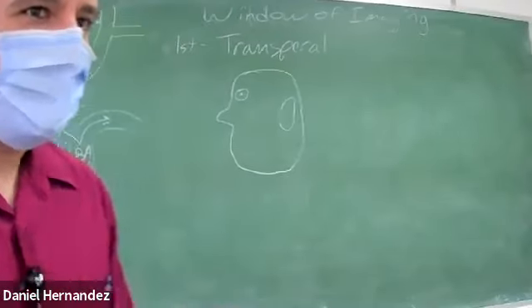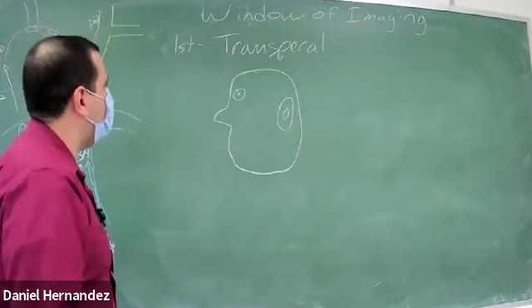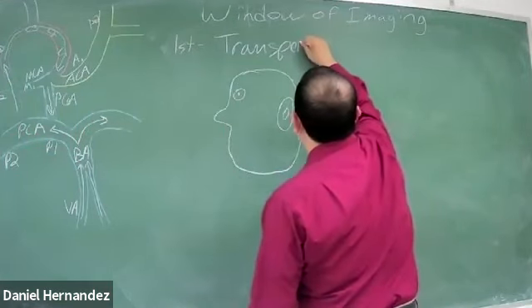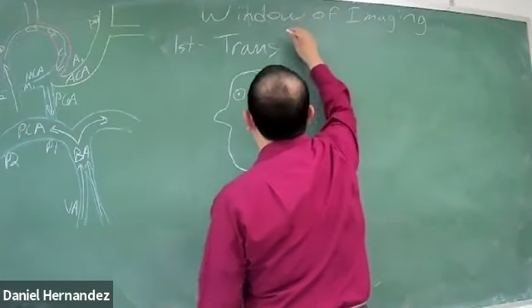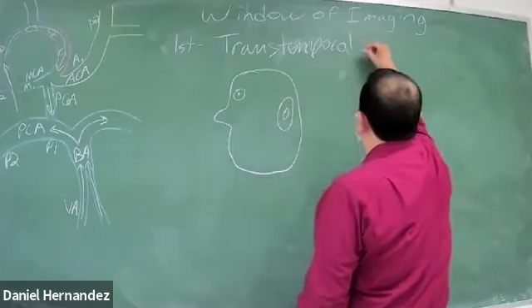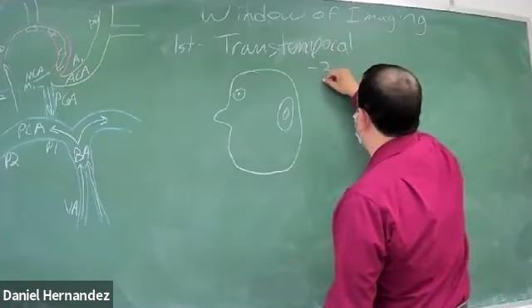That's kind of like a side view of a patient's head. So this is the ear. Within our transtemporal view, we have three windows.